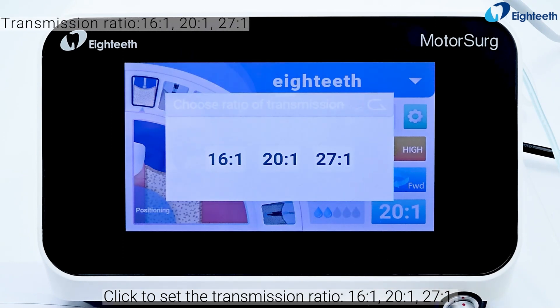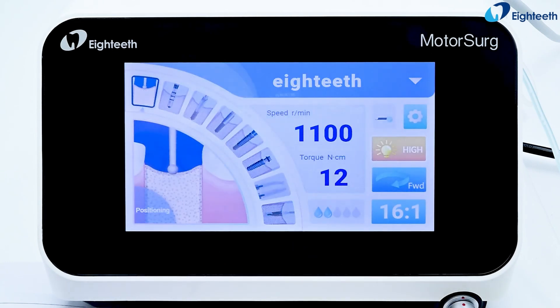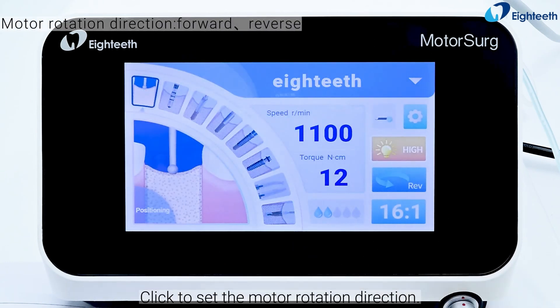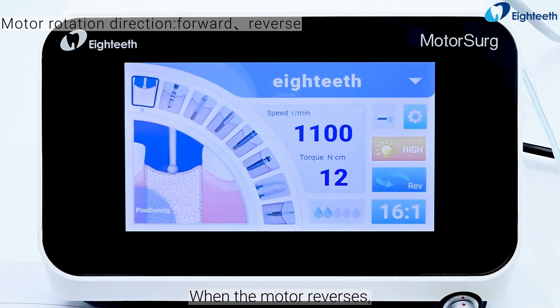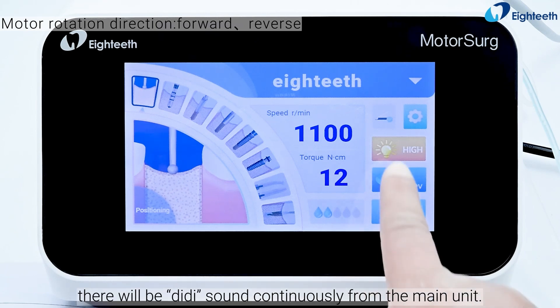Click to set the transmission ratio: 16 to 1, 20 to 1, or 27 to 1. Click to set the motor rotation direction. When the motor reverses, there will be a continuous beeping sound from the main unit.